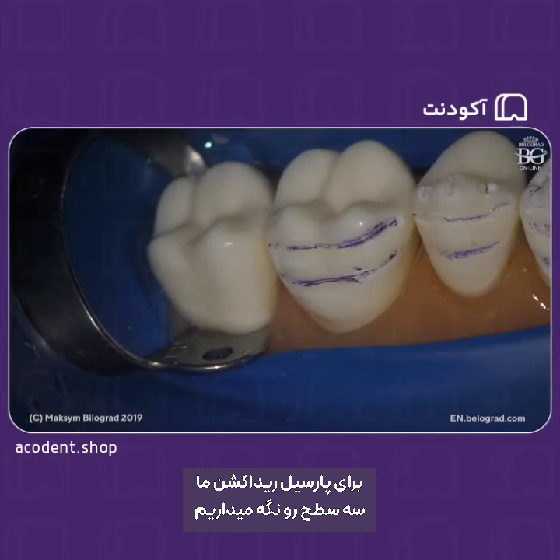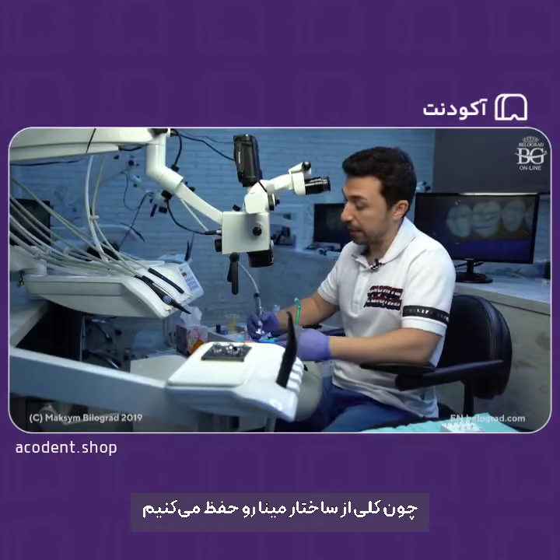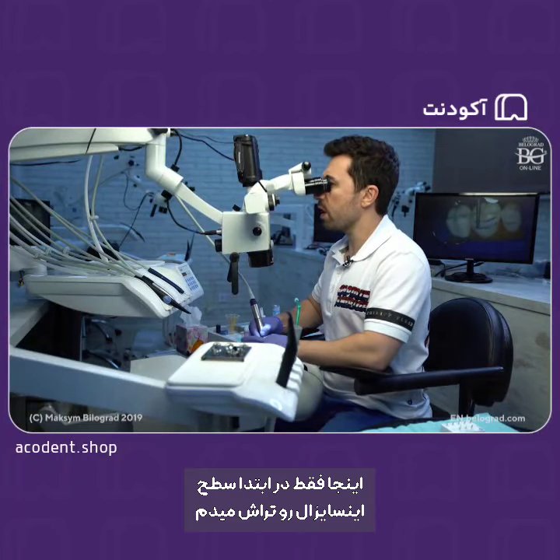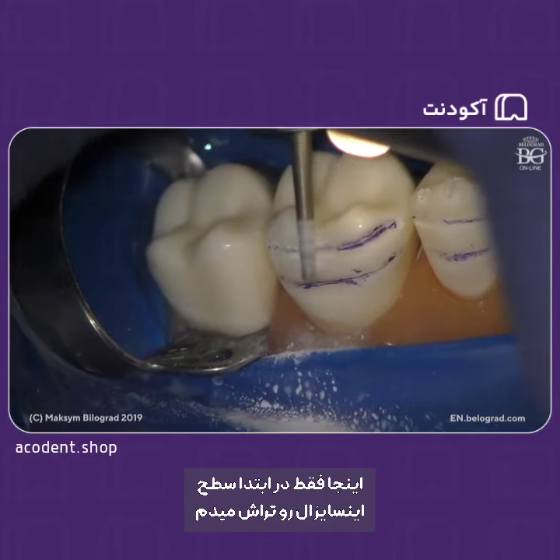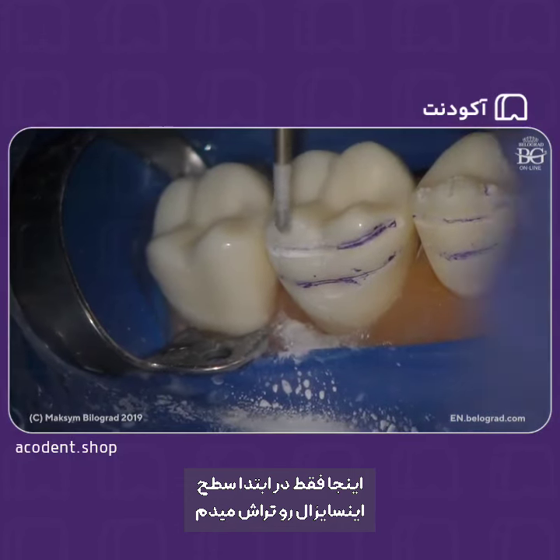In keeping 3 planes, we can be really conservative because we will preserve a lot of enamel. Okay, so let me just start my preparation. So here I just go to the incisal plane. Let's assume this is the incisal plane, and I would prepare until I need a little bit more water.